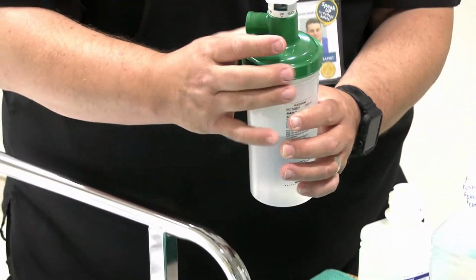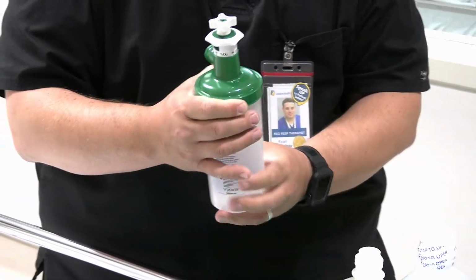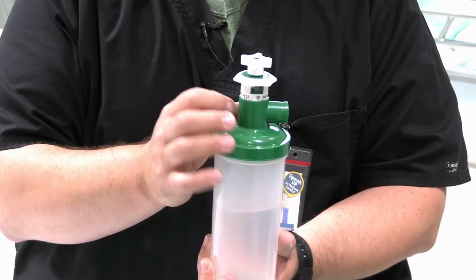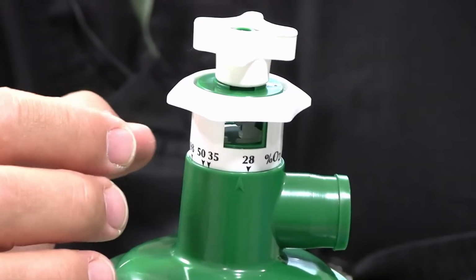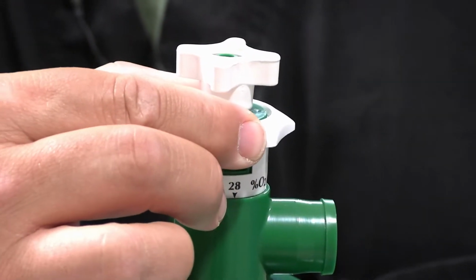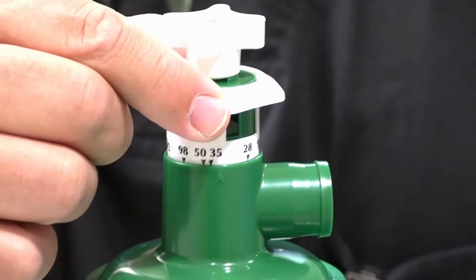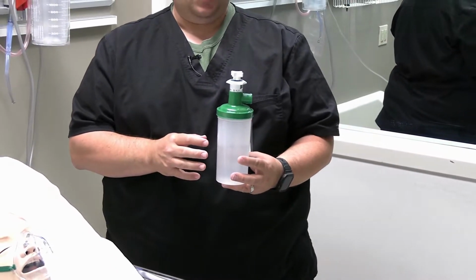I'm going to screw the lid back on, and then down here on the collar you'll see that there is an arrow and your graduations for your FiO2 settings. So right now that's set to 28%. So what I'm going to do is just dial the collar to get to 50. So we have our large volume nebulizer set up and ready to go here.